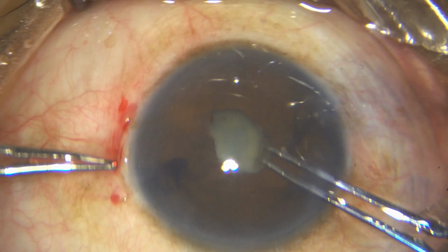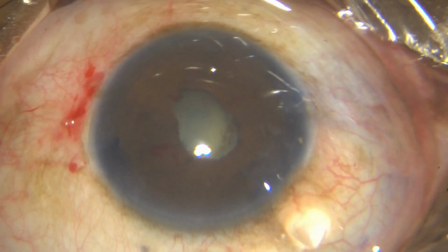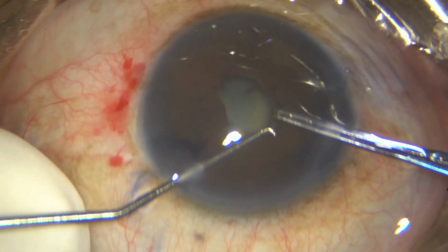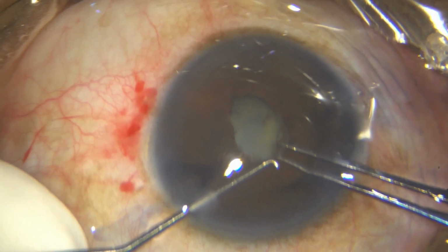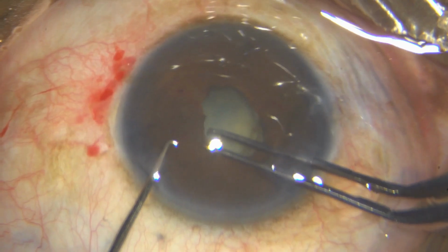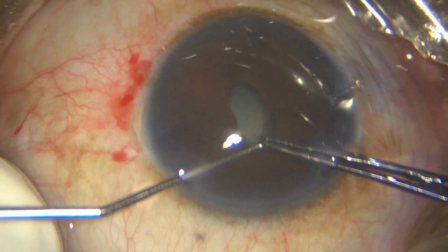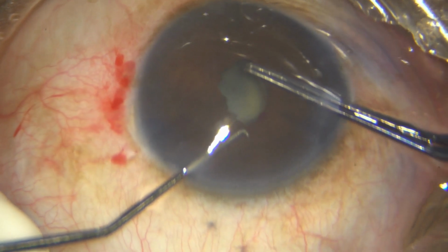And all the time I am very carefully looking at the root of the iris. You can already see some bleeding spots, and this is a cause for worry. See, even though I try to pick up the membrane with the Sinskey and then hold on to the membrane, I am not able to tear it at all. I have tried several attempts, and I think it is getting a little dangerous. I don't want iridodialysis. So I even try to hold on to the iris with my Sinskey hook and pull off, but it just didn't give way. So finally I gave up, and I decided to just put in the iris hooks.